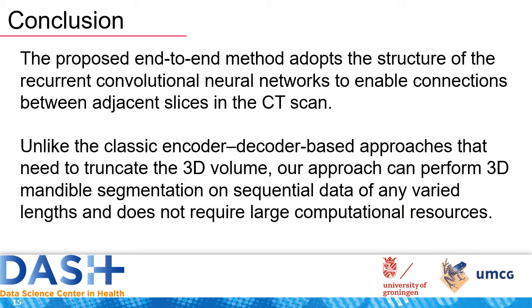In conclusion, the proposed end-to-end method adopts the structure of recurrent convolutional neural networks to enable a connection between adjacent slices in the CT scan. Unlike the classic encoder-decoder-based approaches that need to truncate the 3D volume, our approach can perform 3D mandible segmentation on sequential data of any varied length and does not require large computational resources.